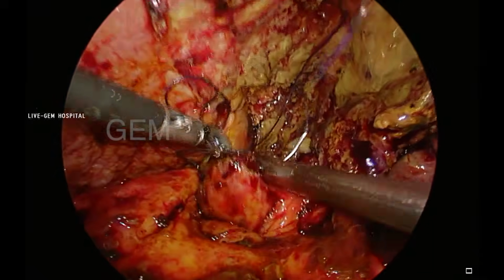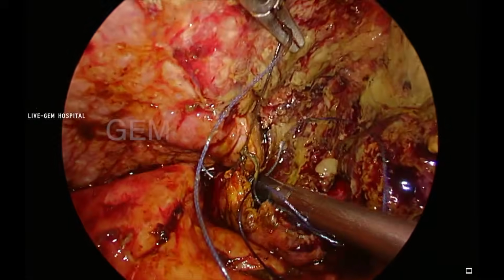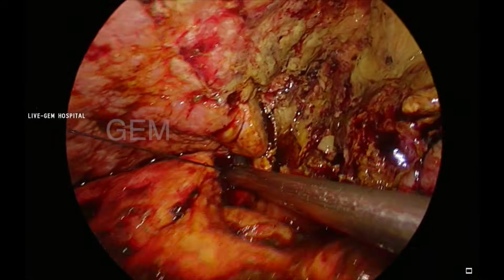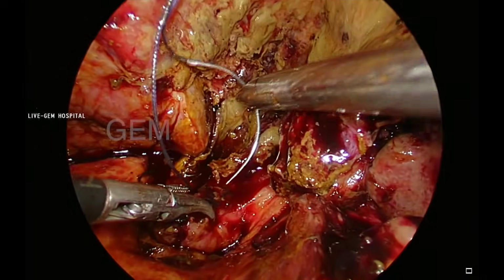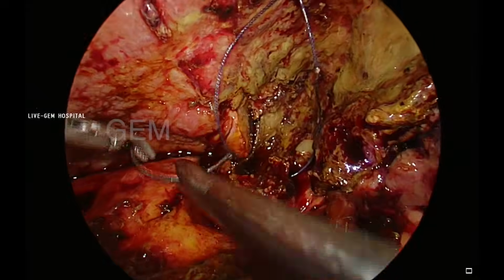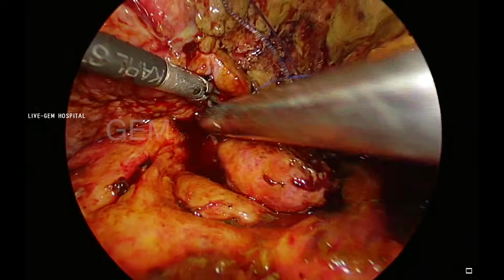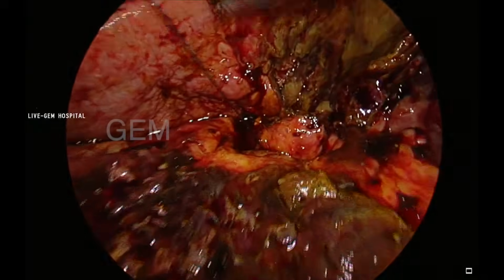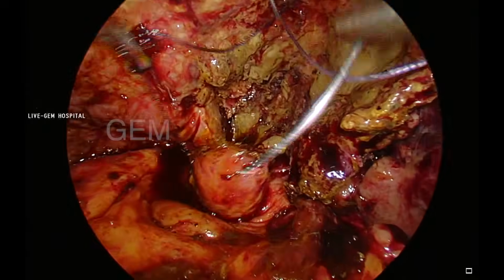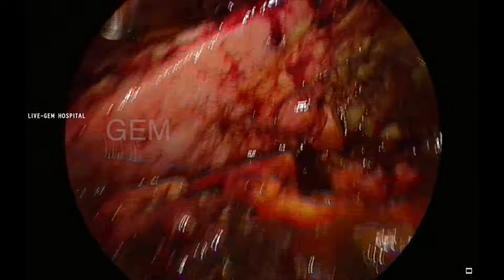That's why if you leave a little bit thicker tissue, the cut through will not be there, because it's a friable thing. That may be the reason I leave some part of the infundibulum. This is the only little viable portion of the gallbladder, because your entire gallbladder has become gangrenous. So we need some tissue to hold when you are taking the suture. So I think it's better you leave some portion like this.